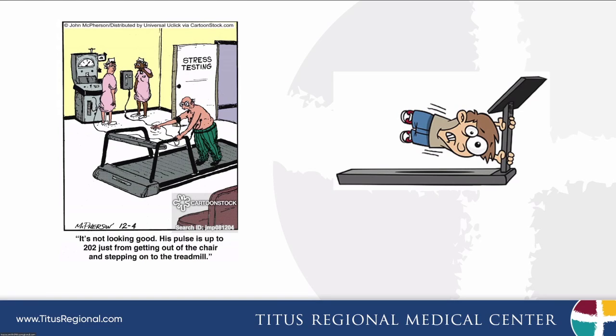Again, not all patients are going to be able to walk on a treadmill, and that's a potential problem as well. So we've developed other schemes where we can do different types of stress tests with patients who are not able to adequately walk on a treadmill.